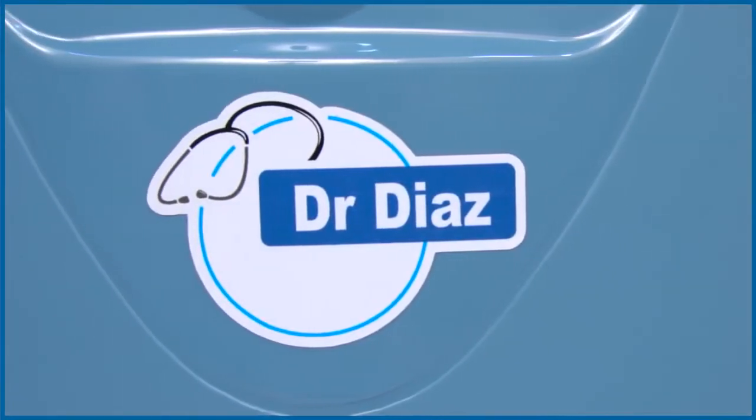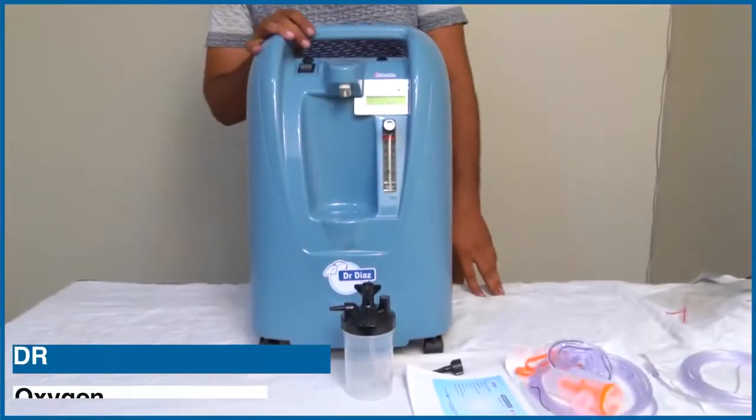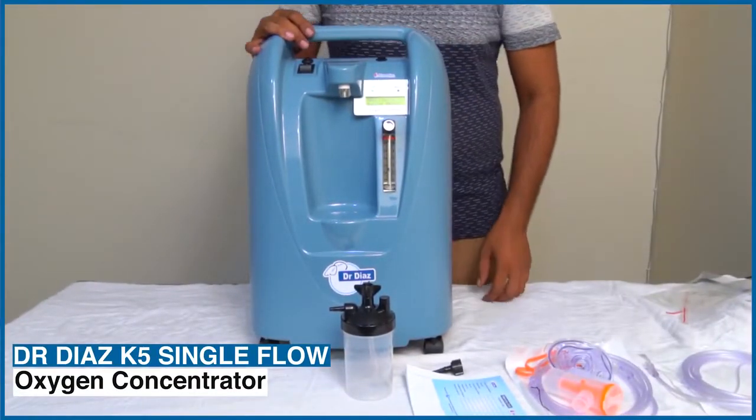This is Dr. Diaz K5 Single Flow Oxygen Concentrator with 5 litres of oxygen capacity.